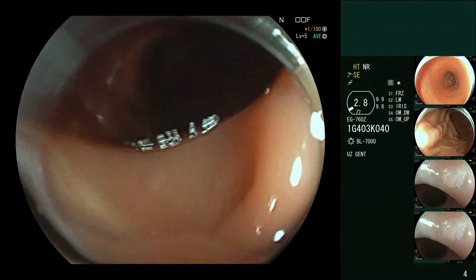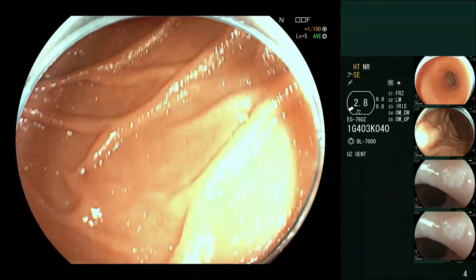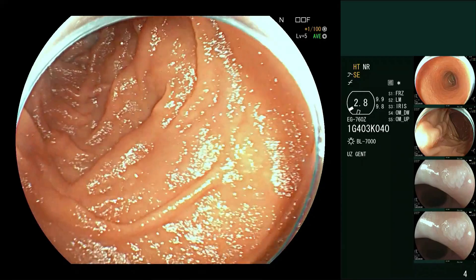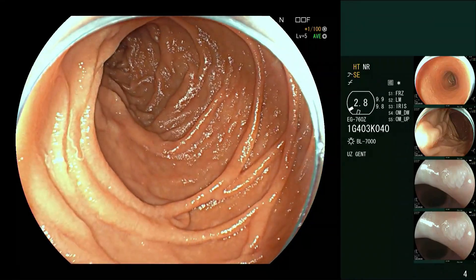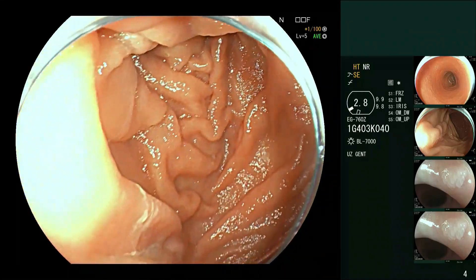There are lots of technique videos on the site showing how to go around from the first to the second part of the duodenum if you're having trouble, because it can be a little tricky when you first start. Here we've got a nice view of the second part. With this particular endoscope we can get a nice view of the papilla just by pushing in. You can also use a cap to see the major papilla.